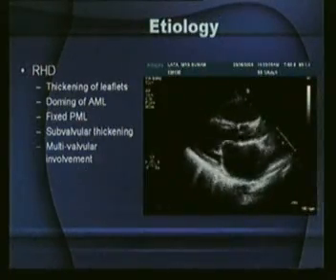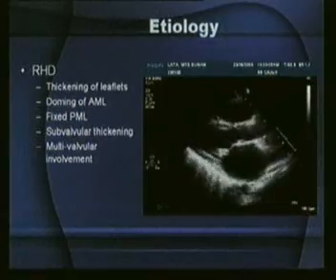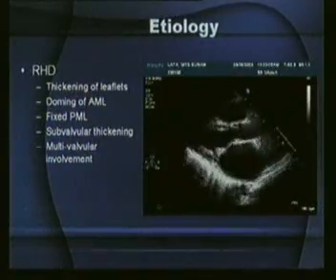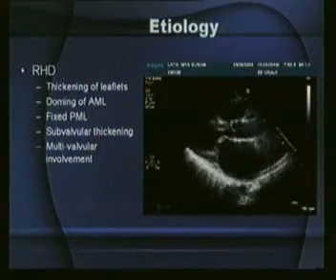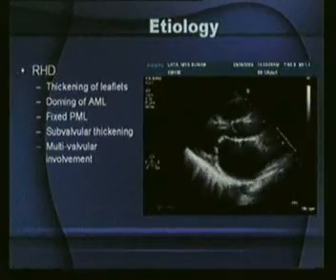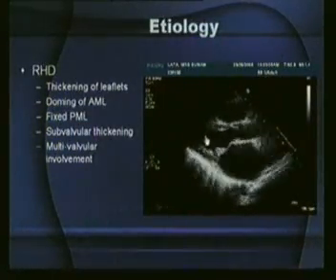Once you are looking at the patient, there is a history of shortness of breath, even PND. The X-ray shows pulmonary arterial hypertension and pulmonary venous hypertension. The ECG shows a left atrial enlargement, with a normal sinus rhythm. Then you have placed the transducer in the parasternal long axis view.